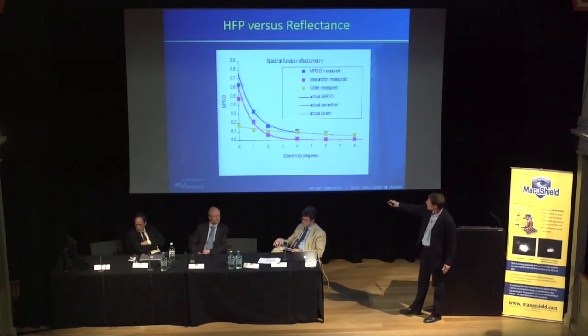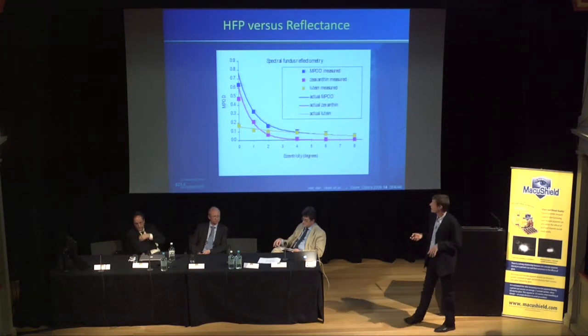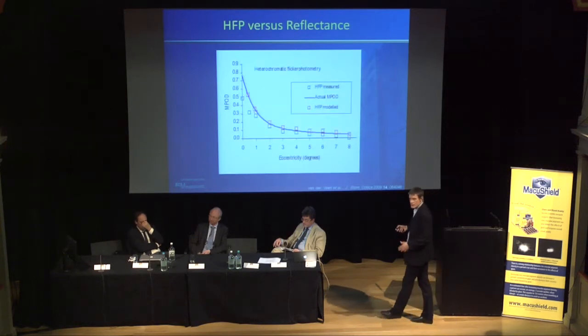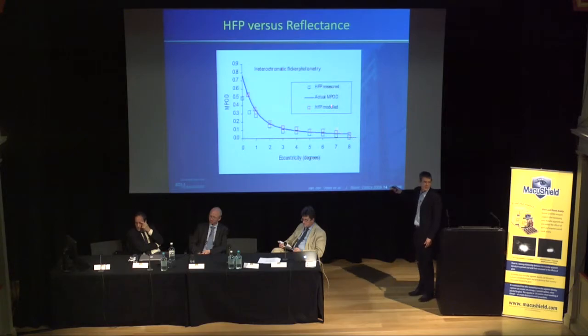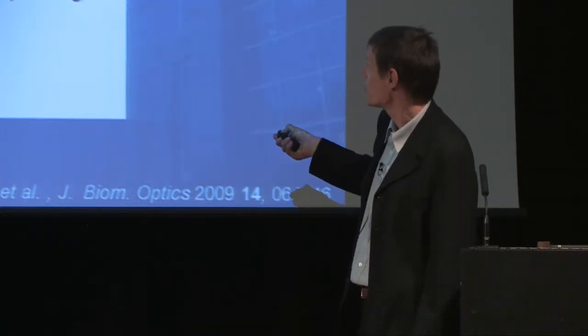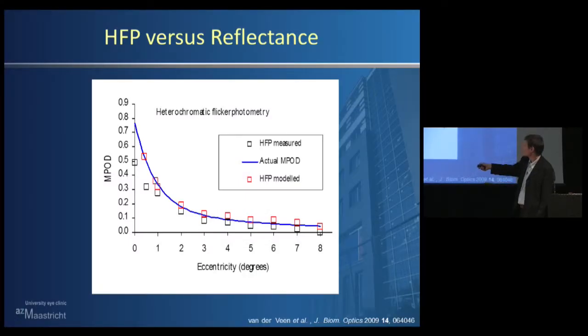So then this is the zeaxanthin, lutein, and the actual macular pigment optical density. That's the underlying optical density of the macular pigment. I then tried to use this blue line to understand the psychophysical measurements. For a start, psychophysical measurements assume at 8 degrees there's a 0 point. There isn't. There's a small offset, 0.04, 0.05. So you should shift your black squares a little bit up, as we did here.